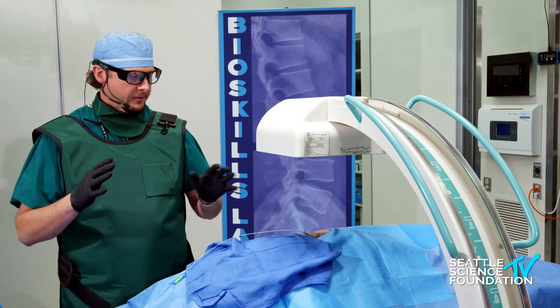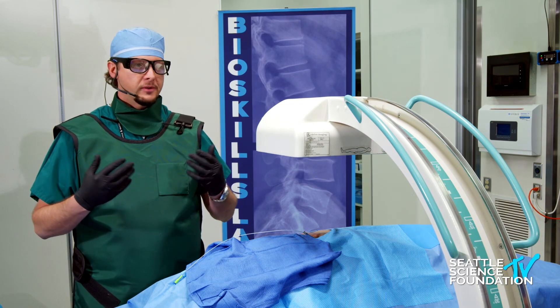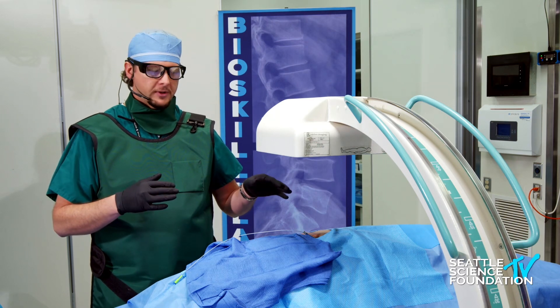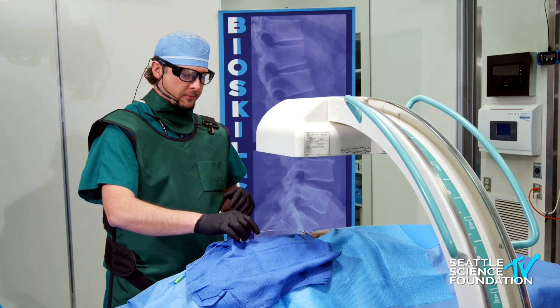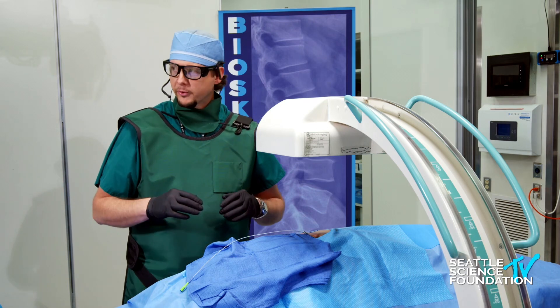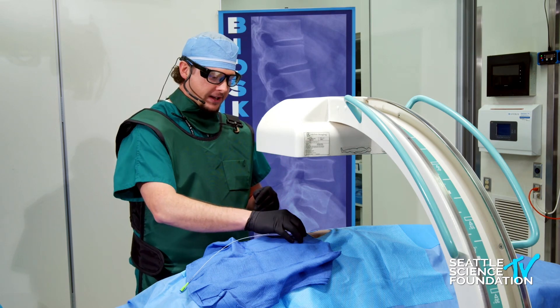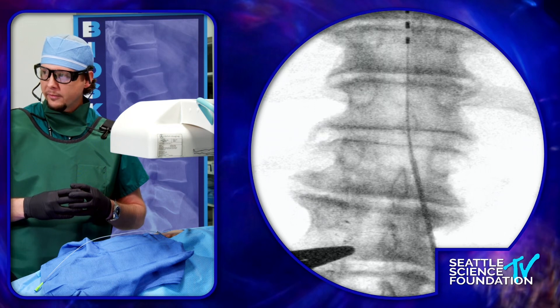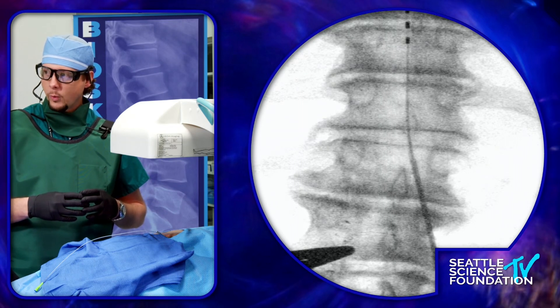Before you're going to be doing this, generally what I do is a thorough look at imaging. Obviously, you've seen the patient, physical examination is very important, but looking at advanced spine imaging for access and appropriateness of lead placement — not only at entry, but also up into the thoracic levels. Since we don't have the benefit of that, I took a little liberty to come in early, especially since our patient specimen has already failed multiple treatments including decompression, interspinous fusion, and DRG. I went ahead and placed one lead in here.